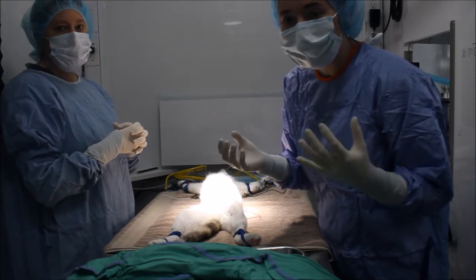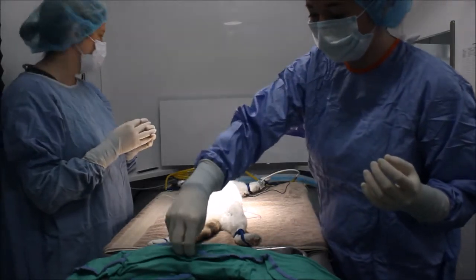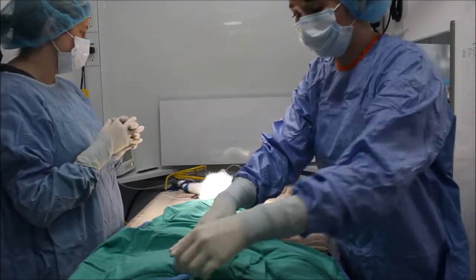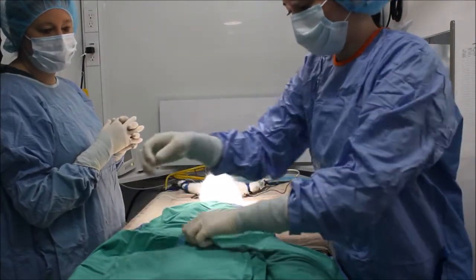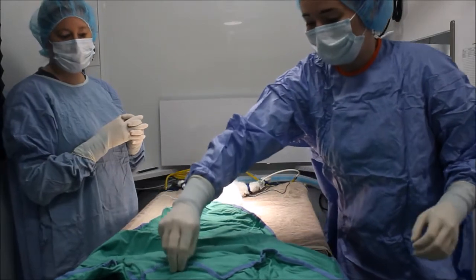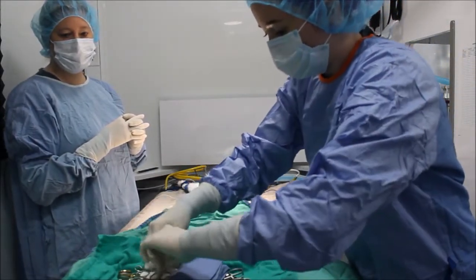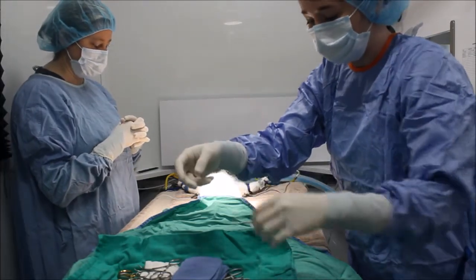Now that I'm gowned and gloved and sterile, we're ready to start surgery. I'm going to open this flap and pull it towards my patient — so now this part is sterile. I'll open this one away from my patient. Now I'm going to open the pack and show the steam indicator strip, which confirms the inside of the pack has been exposed to appropriate steam.